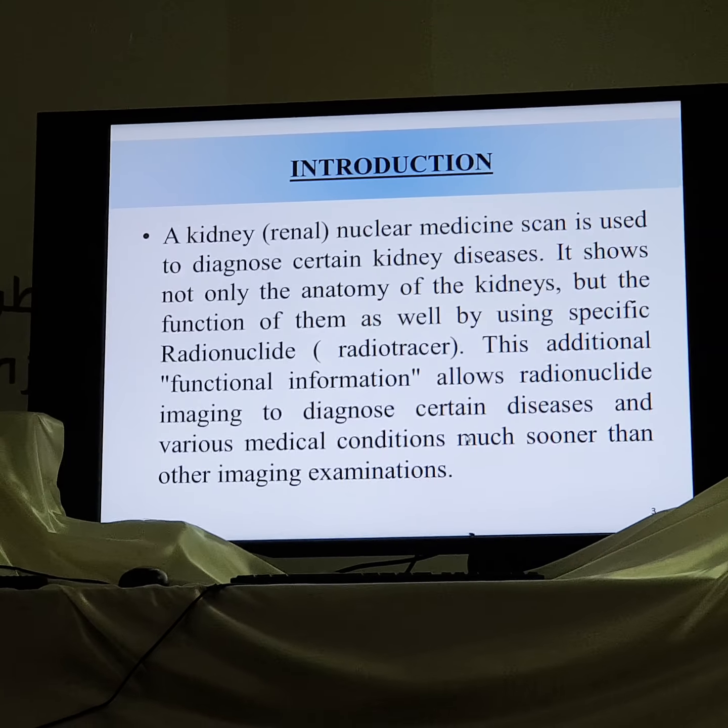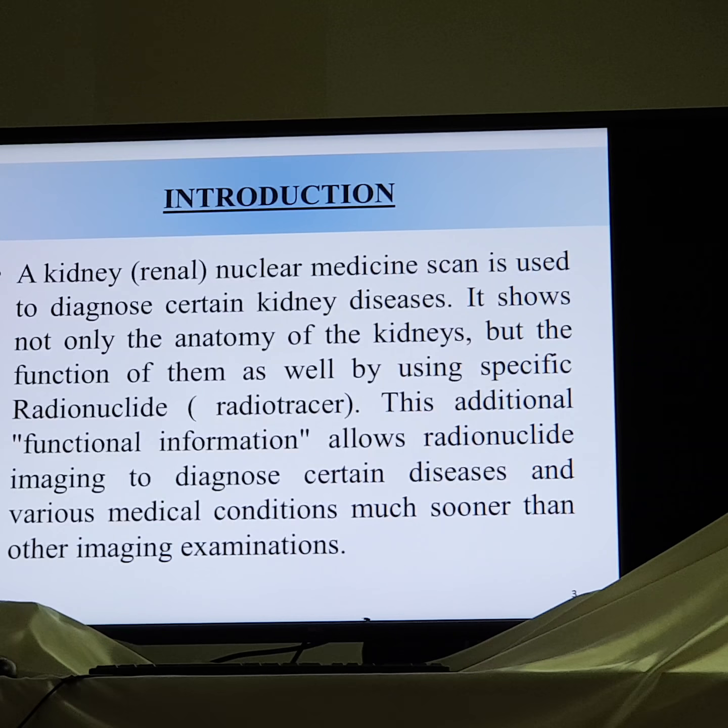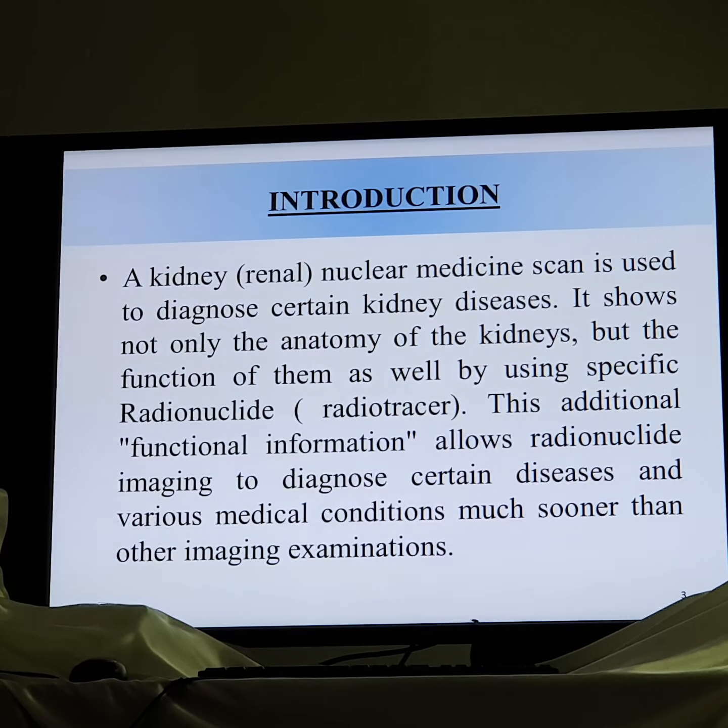Okay, kidney, I think all of you know the kidneys. We are using a radiopharmaceutical to scan for kidney disease. The nuclear medicine scan helps to find out the anatomy and the disease of the kidney, especially the function of the kidneys. It's mainly the gold standard test to know the exact function of the kidneys.